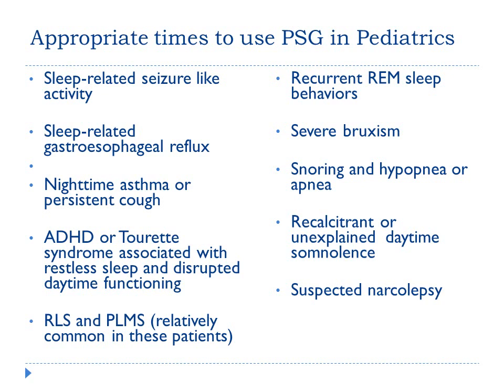Also with recurrent REM sleep behaviors, severe bruxism, snoring and hypopnea or apnea, which we've already identified, or any unexplained daytime sleepiness, and anytime you suspect narcolepsy. Those are all indications for PSG in our pediatric group. Let's go on to our next slide.